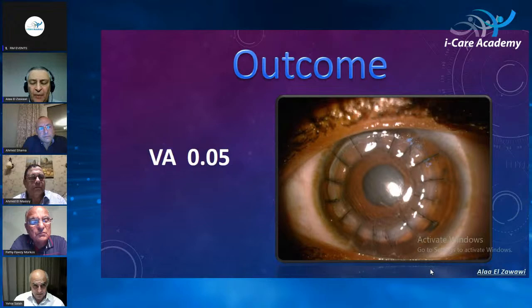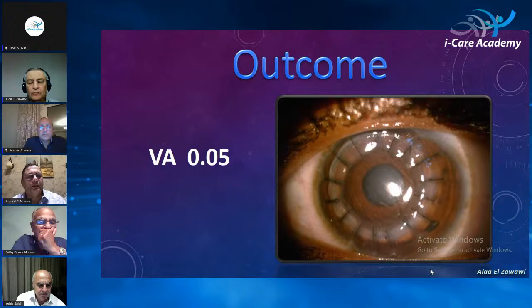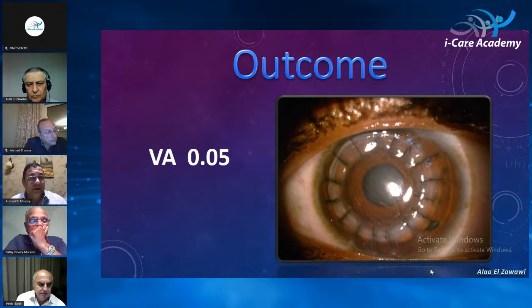And I think if you put the Flieringa ring, because the Flieringa ring will pull out the sclera and the area of the limbus, the lens wouldn't be under this pressure. I'm not sure, but I'm thinking mechanically, because this Flieringa ring will keep the sclera away from the iris lens diaphragm. Maybe. Yes, and the second point is that I did once an artificial keratoprosthesis with one of the posterior segment surgeons. I removed the cornea, put the artificial cornea, and then took the sutures and he did his vitrectomy and put his silicone, and then I put the graft. It's a very tedious procedure, but it helps a lot at the time.